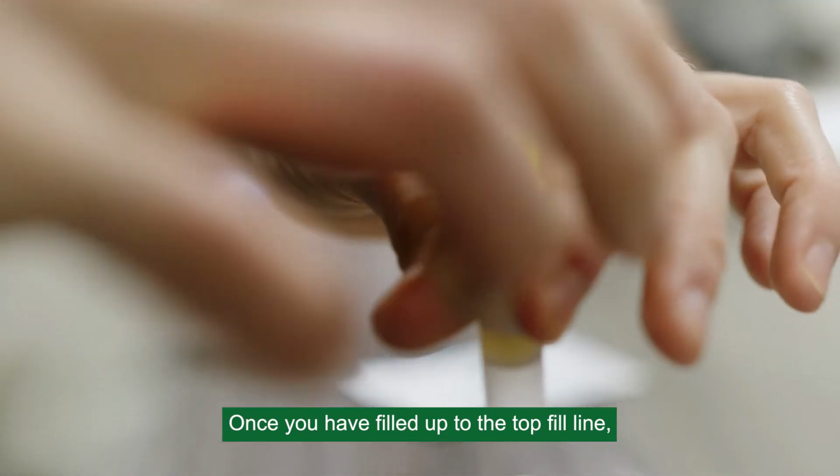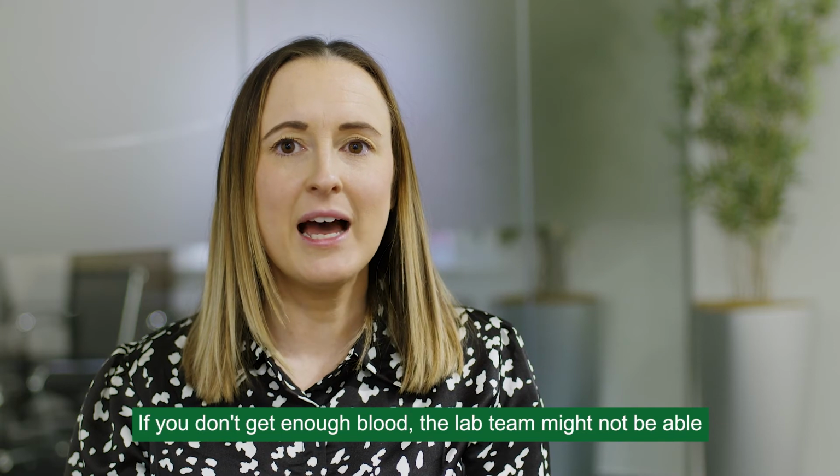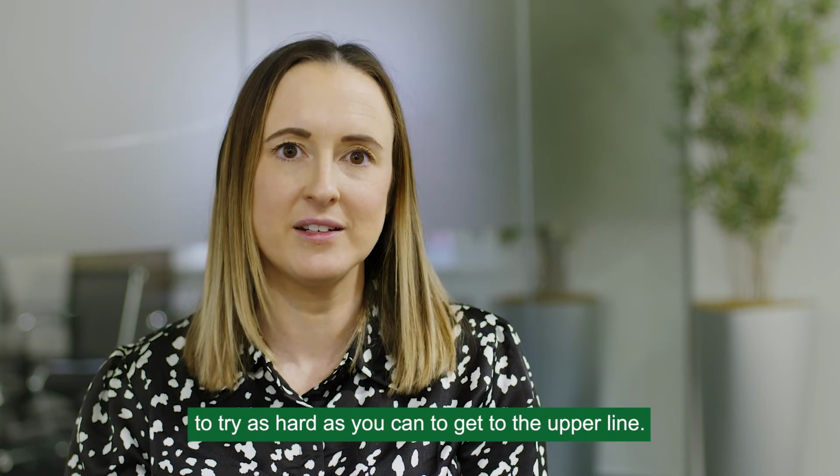Once you have filled up to the top fill line, push the cap firmly back onto the tube. If you don't get enough blood, the lab team might not be able to process your blood sample, and you may have to repeat the test. So it's important to try as hard as you can to get to the upper line.